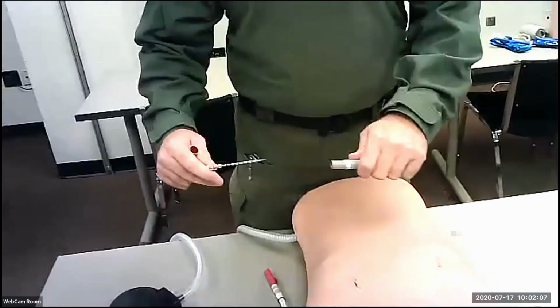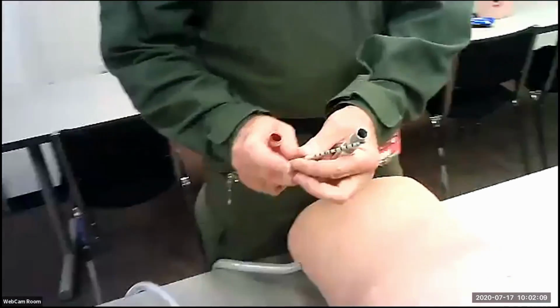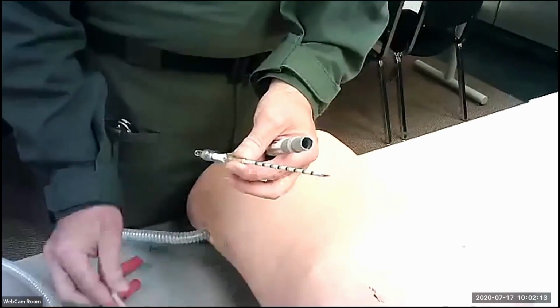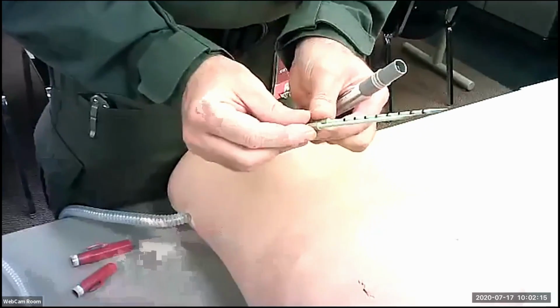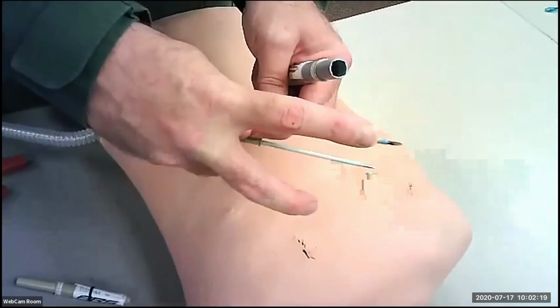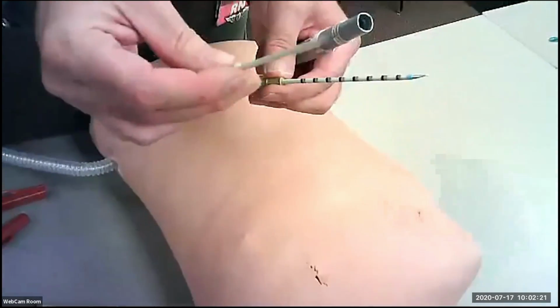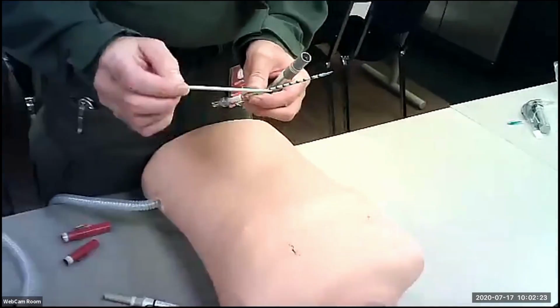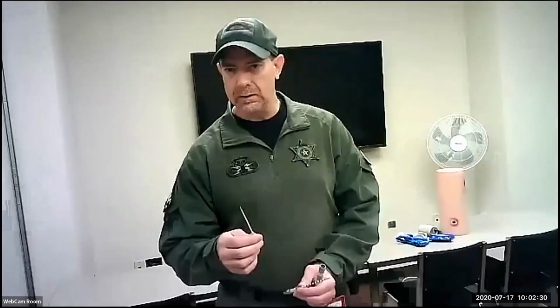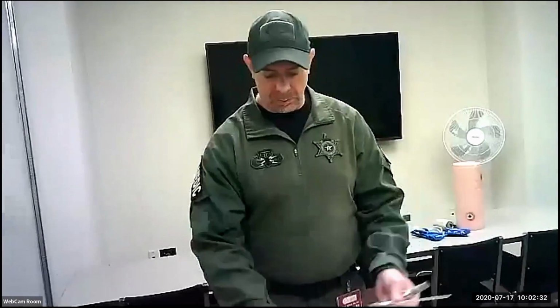This is a SPEAR. This is the new system that you saw in there. The biggest thing with SPEAR in this one is, you see the difference, quite a bit of difference on there. And these have got extra holes along here. One of the biggest things with these needles is they tend to clog up. Once I get in there, it tends to clog up with blood, and I have to either purge it out or put another needle in your chest. There's many pictures out there with multiple needles in people's chests, the lung keeps dropping again.